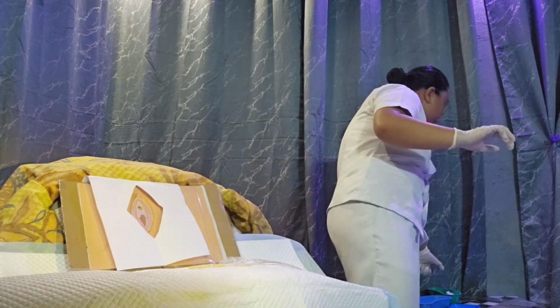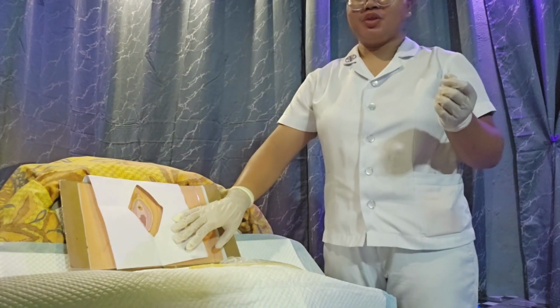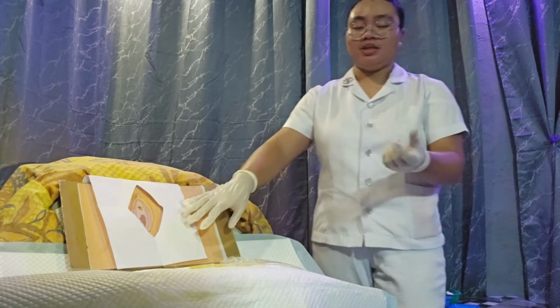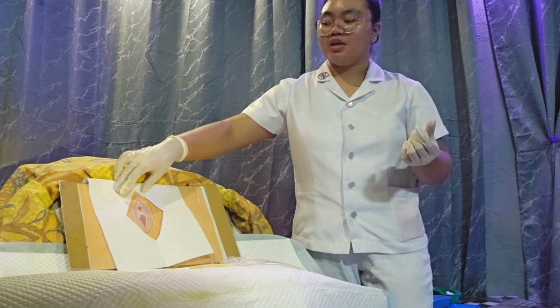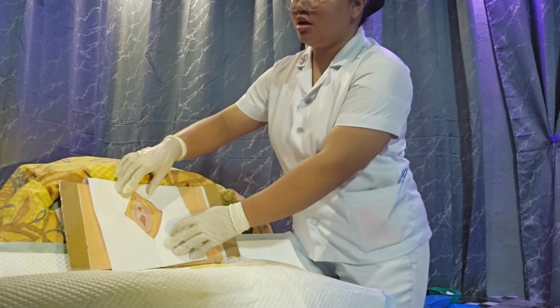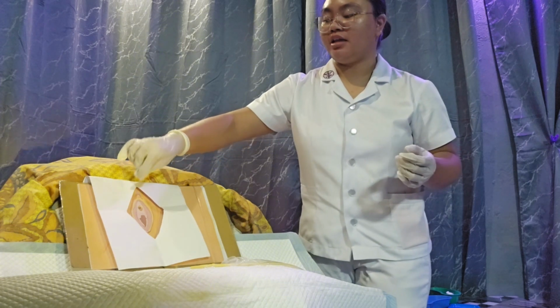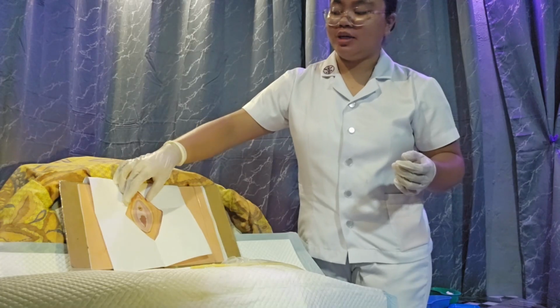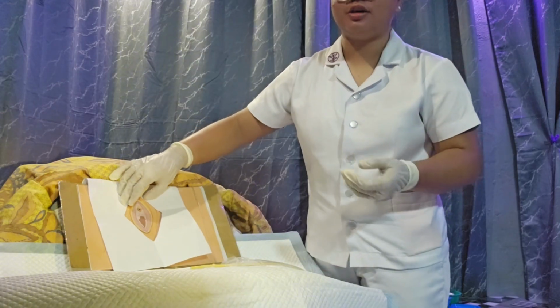So after ensuring that the meatus is already clean, we are now going to pick up the catheter 3 inches from the tip, and place our thumb and finger of the non-dominant hand into the genital area, specifically in the labia minora, and spread the folds gently to maintain the comfort of the patient, and also to have an easy visualization of the urethral opening.